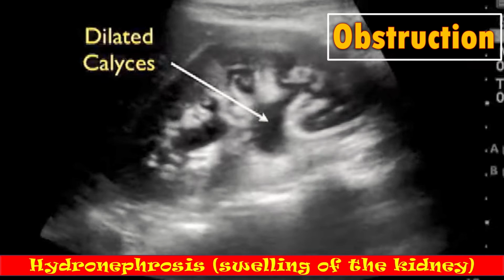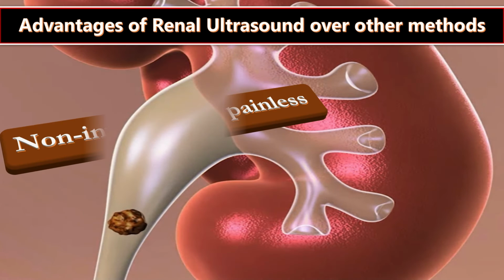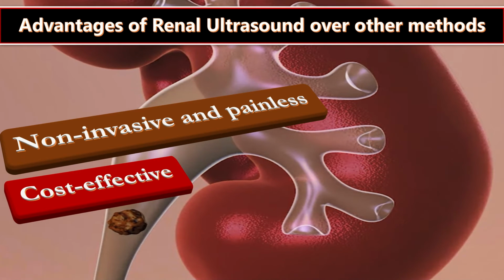What are the advantages of renal ultrasound over other methods? First of all, it is a non-invasive and painless technique. Unlike CT scan, ultrasound does not use radiation and is generally more comfortable for the patient. Secondly, it is cost effective. Ultrasound is typically less expensive than CT scans.